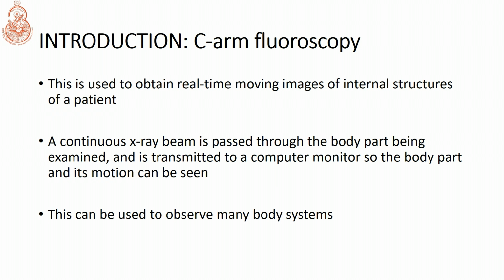The C-arm fluoroscopy uses the same principle as conventional radiography. Here we use the same X-ray photons in obtaining the images.